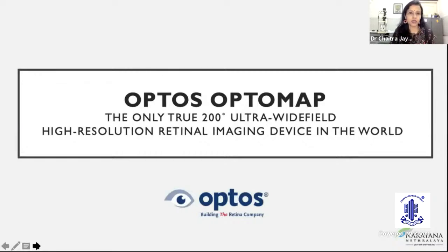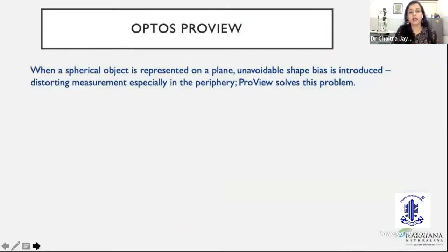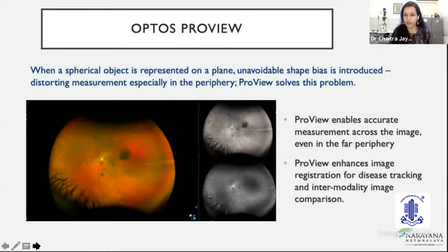So this is the device that we are using, the Daytona in particular, with just brief specifications. Madam was mentioning that because this is 2D and the retina is a curved structure, we may not be actually able to see it due to parallax. So there is also something called ProView, which solves this problem. Initially, it helps us get accurate measurements across the image, even in the far periphery, and it enhances the image registration also for disease tracking. And intermodality image comparison is possible.